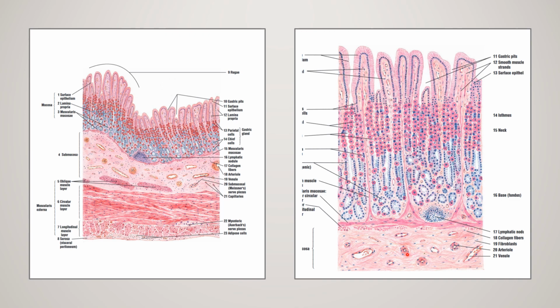Now if you go to the submucosa, this is your submucosa. As I told already, the common features: it is made up of moderately dense connective tissue. So you will have blood vessels, nerves and all you can make out here. Diffusely placed lymphocytes you can also make out. That is common for your esophagus also. Next important point, in that submucosa you will have a plexus of nerves. What is the name of that nerve plexus present in submucosa? It is called Meissner's plexus, Meissner's nerve plexus.